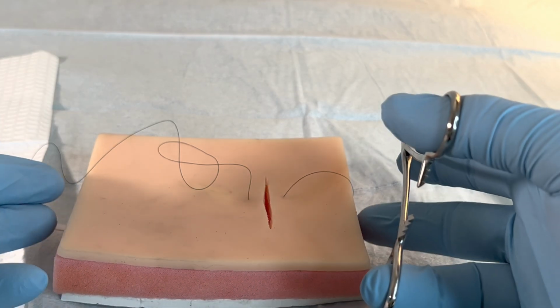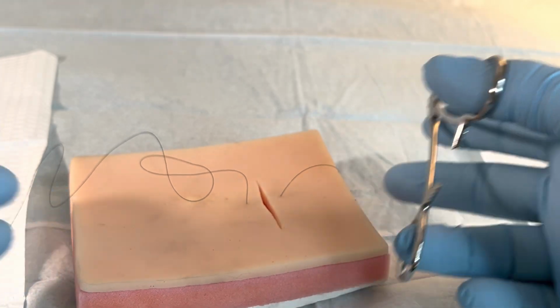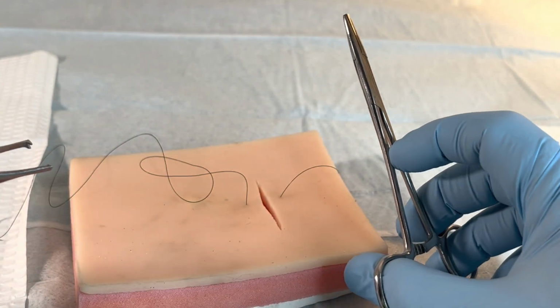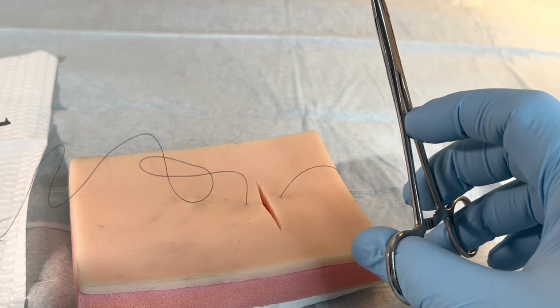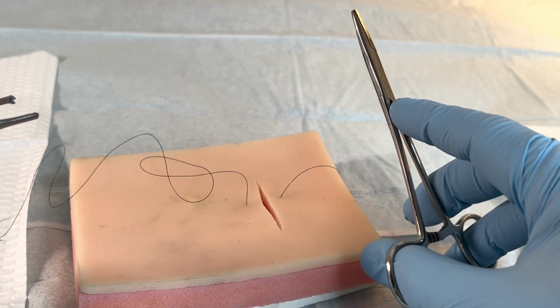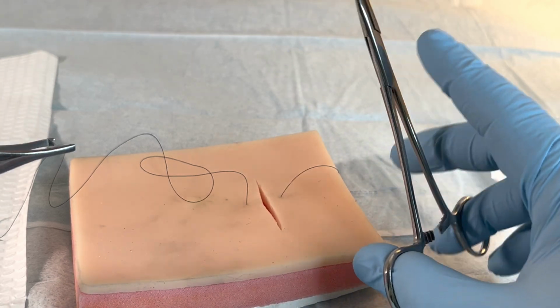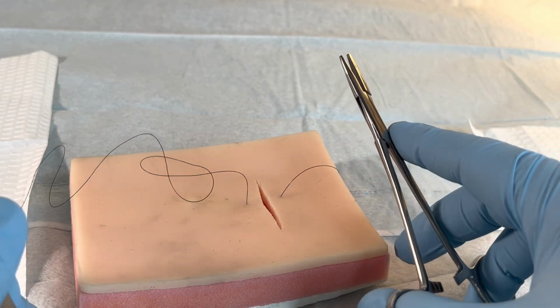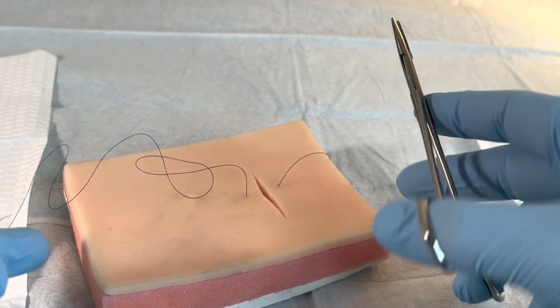So as you may have gathered thus far, I really do like to try to break things down to their simplest points. So for the instrument tie, in training, there were several times where I might have lost count of whether I was going right to left or left to right. And so in an effort of saving myself some of that mental power, the way I approach this is I just break it down into simple steps that never change.